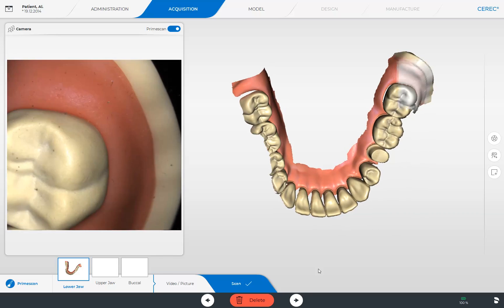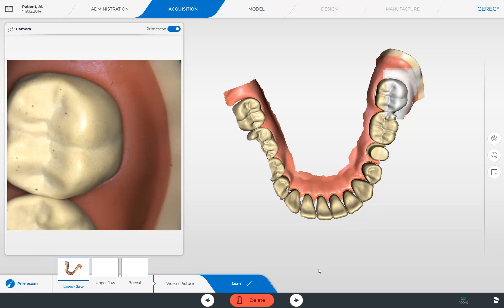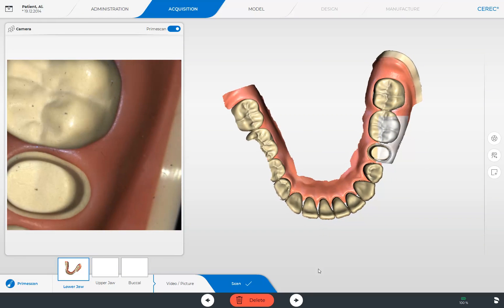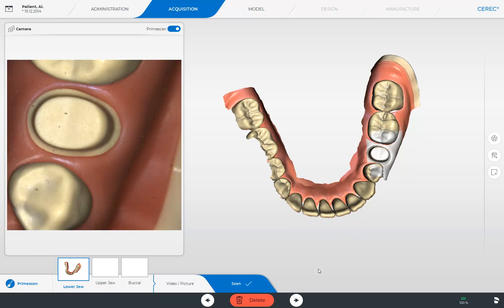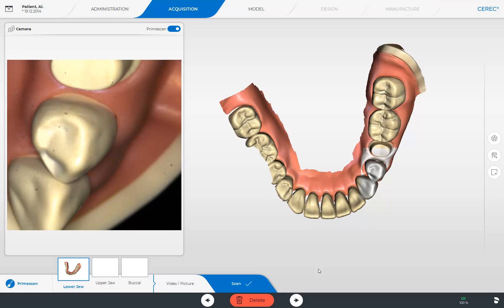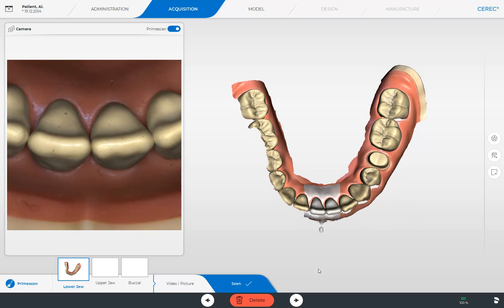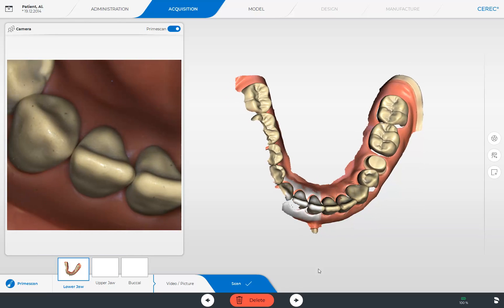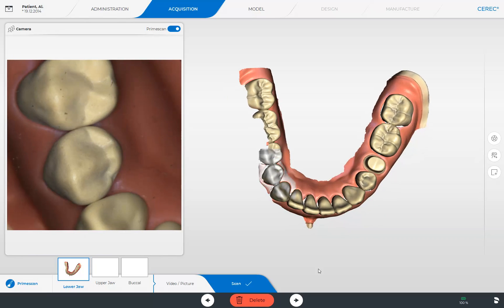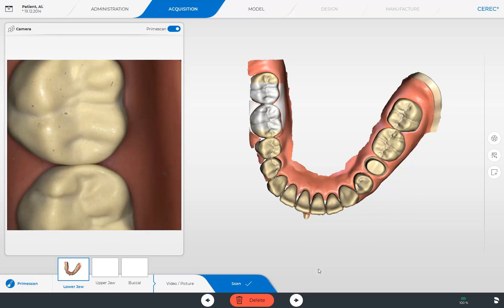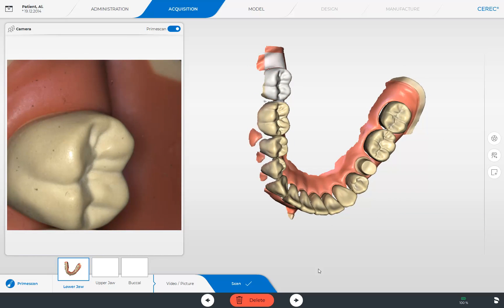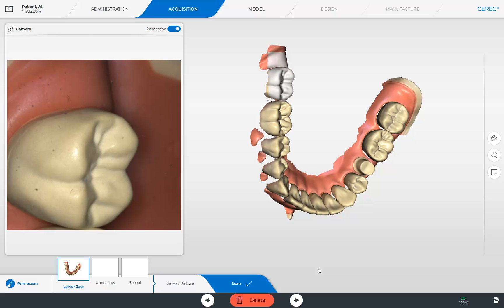From here, we continue with an occlusal scan over the incisal edges in the anterior region until the most distal tooth on the opposite side. After reaching this spot, we sweep the scanner again by 60 degrees to the vestibular and scan back to the most distal tooth on the opposite side.